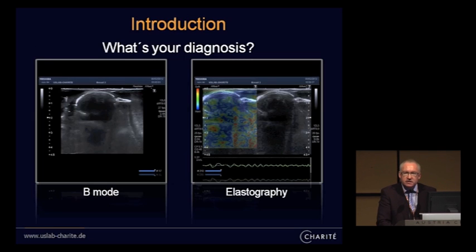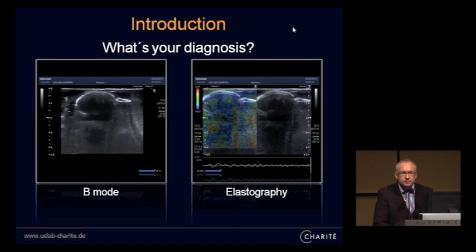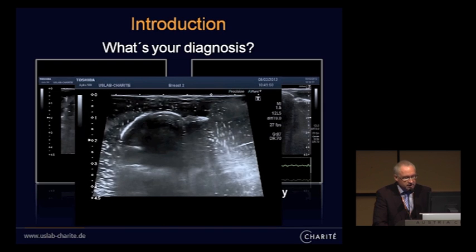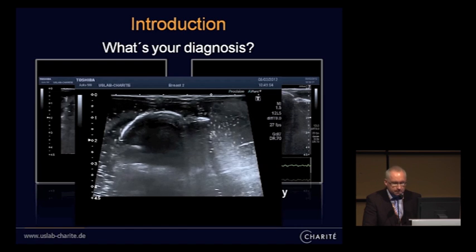Are there any guys in the audience who know the banana experience or banana imaging story? This is a new story. This is the fishing experience. So all of you, you are very highly educated experts. And so what's your diagnosis on this small object? Any idea? Okay, I'd like to show you this in real time. That's the case at the beginning of the experiment in real time.